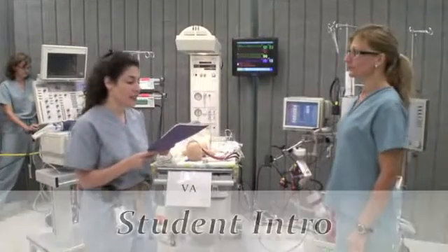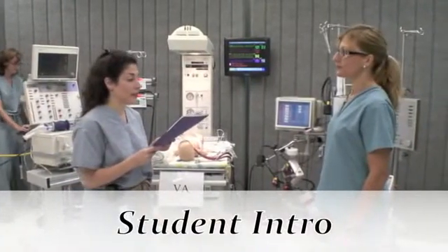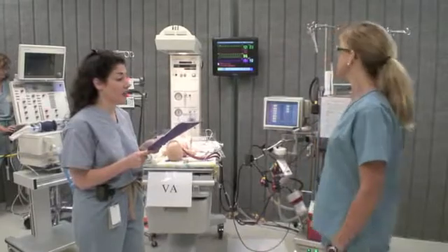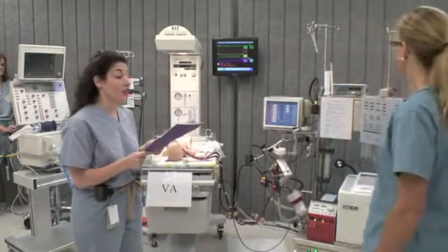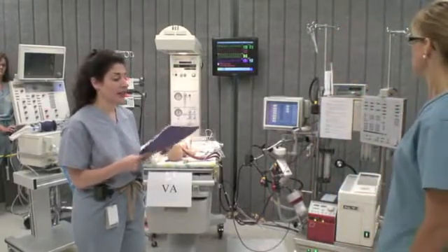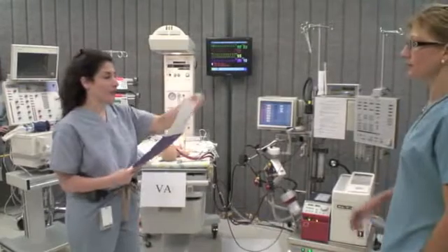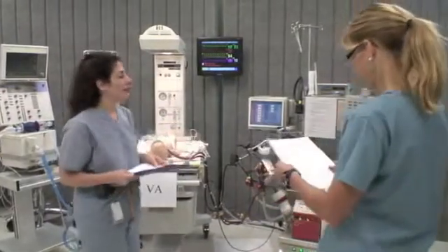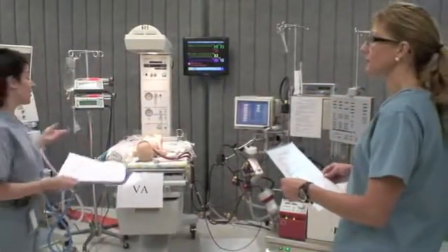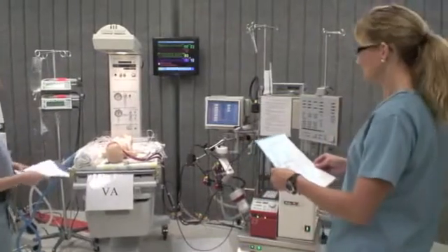ECMO has just been initiated for this infant with meconium aspiration, and everyone is starting to clean up after the cannulation. You are just starting to catch up with your charting, and the second set of gases has returned. I'll be here as the nurse and the assistant — if you need me, direct me to do anything.